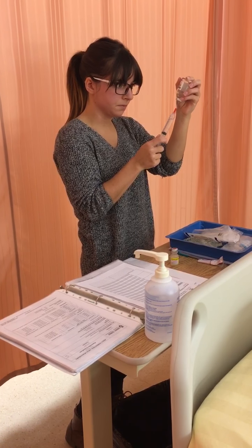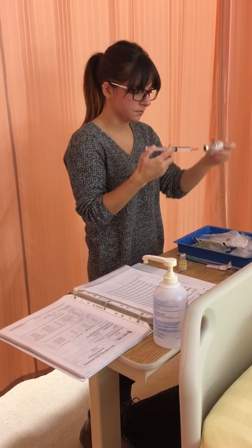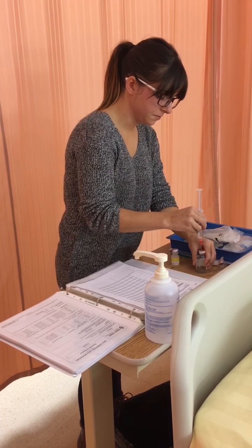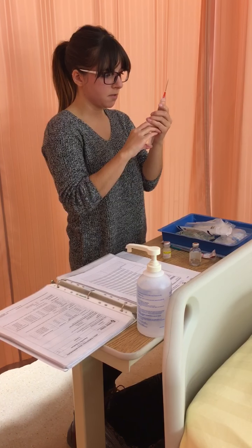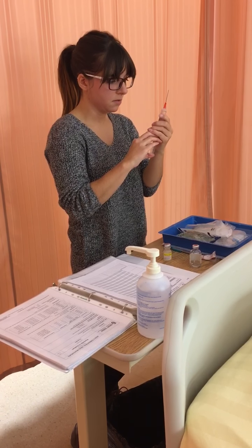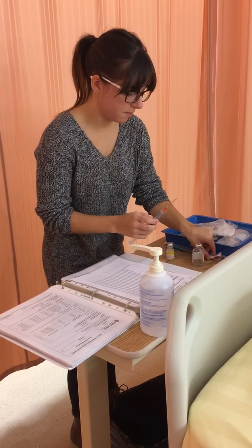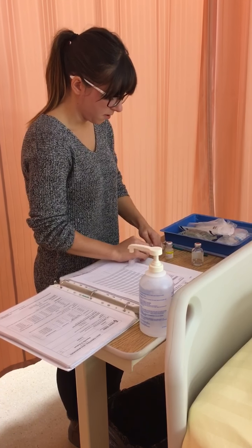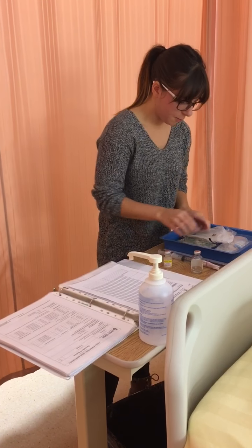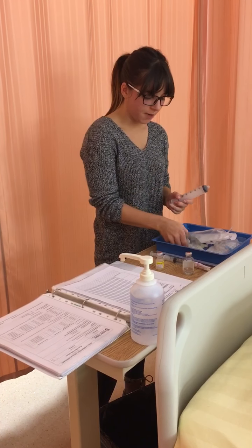Then that gives me a final volume of 2 milliliters, making sure no air bubbles once again. Okay, so we're just going to recap it. Then I'm going to withdraw my 30 milliliters of normal saline from a mini bag.